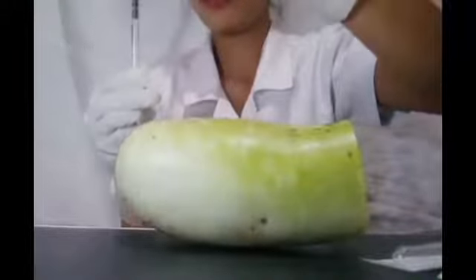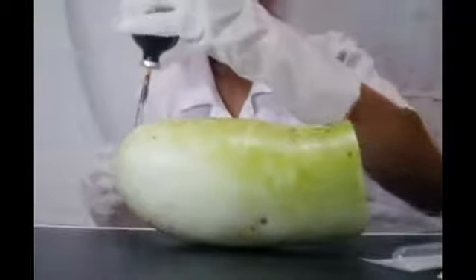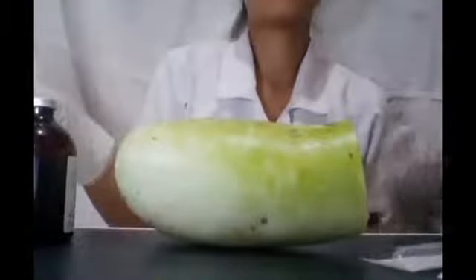So pull 18 units. And here we go. You have 10 out. And next for this, we're ready to go give it to the patient.